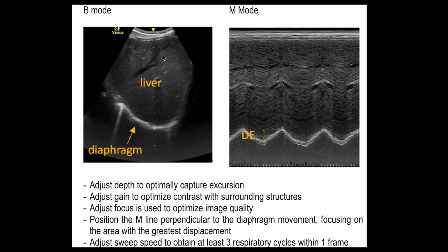As you can see here, this is the liver and this is the diaphragm. Adjust the depth to optimally capture the full excursion of the diaphragm within the window. Adjust gain to optimize contrast with surrounding structures and try to get the best image of the diaphragm. Keep the focus at the level of the diaphragm to optimize image quality.